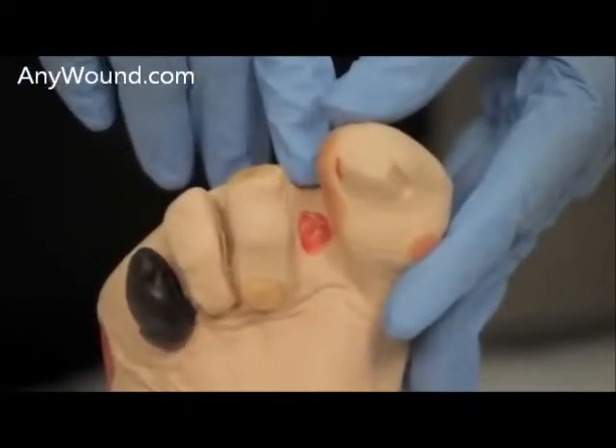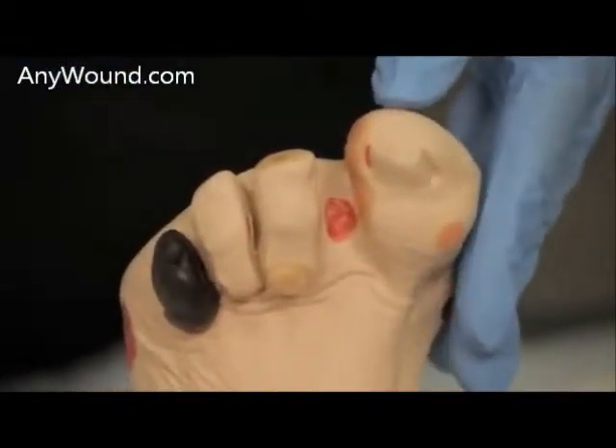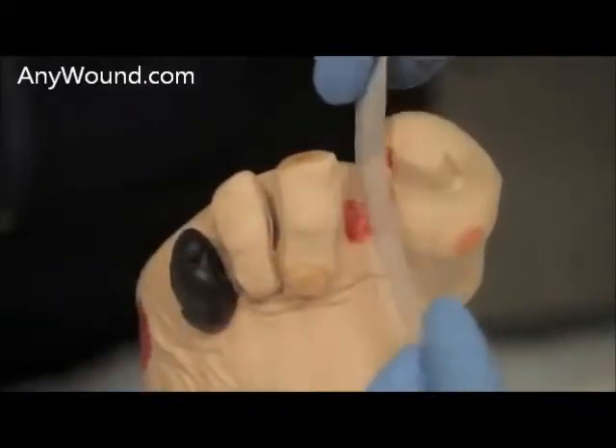The first thing you'll want to do is measure your wound size. This is a one centimeter by one centimeter.